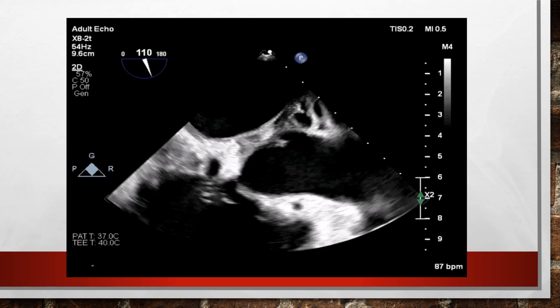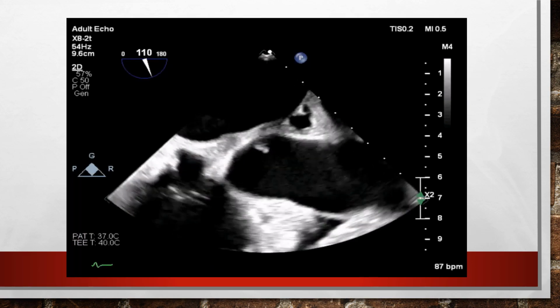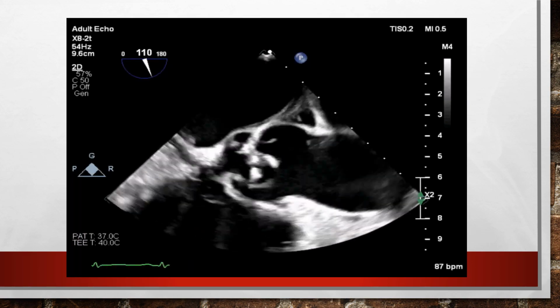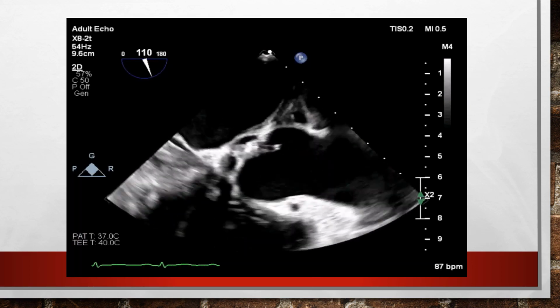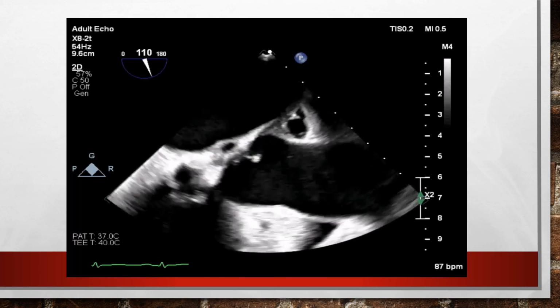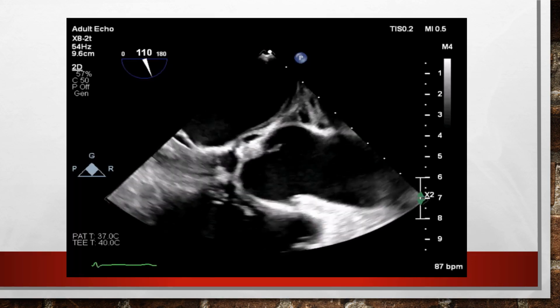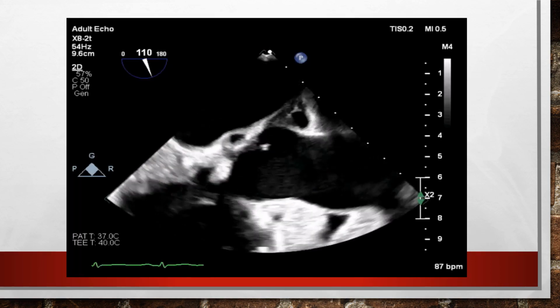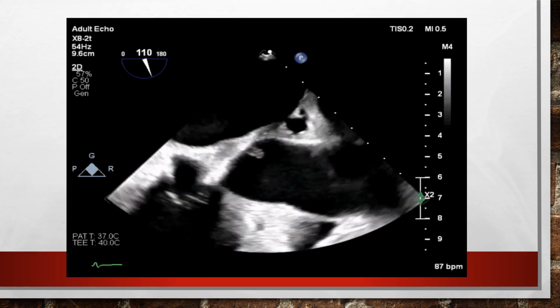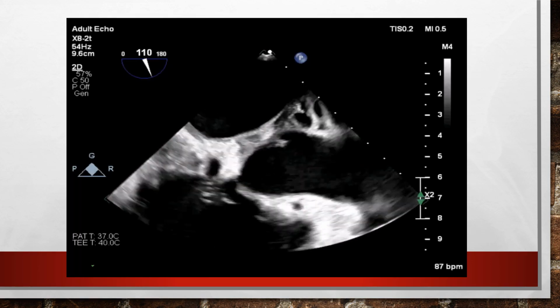As you see in this image, you start to identify there is thickening of the aortic root, and that thickening is extending toward the mitral aortic intervalvular fibrosa. This is diagnostic of the presence of an abscess, and there is an echolucent cavity within that abscess.